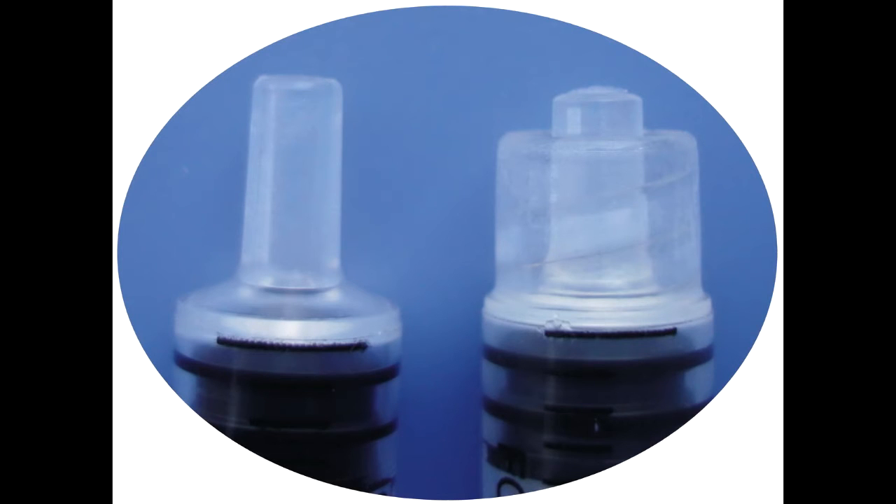Syringes and needles can be affixed using a lure lock or a lure slip mechanism. Illustrated here on the left is a lure slip and on the right is a lure lock. All of the syringes utilized in your LTE course are lure lock. However, most of the needles you encounter will affix to the safety device with a lure slip mechanism.